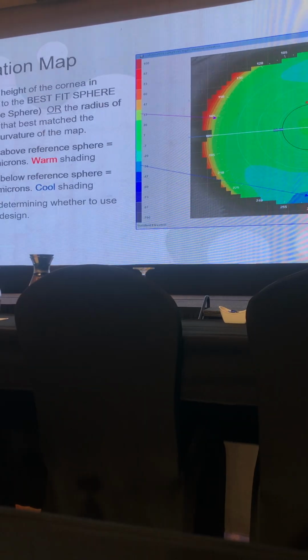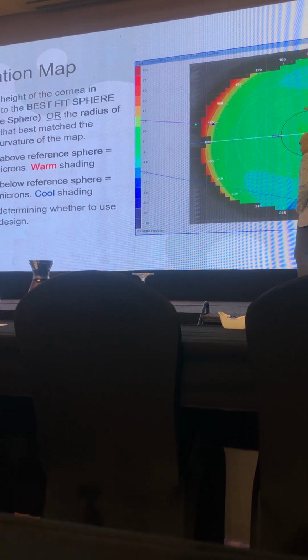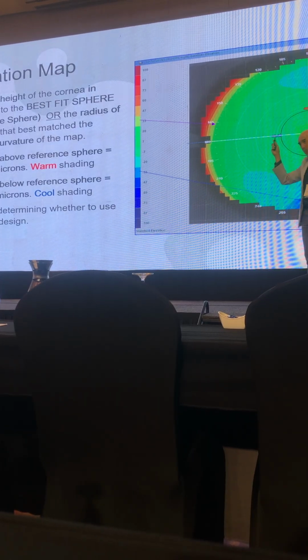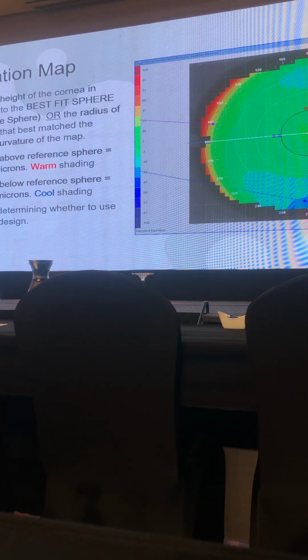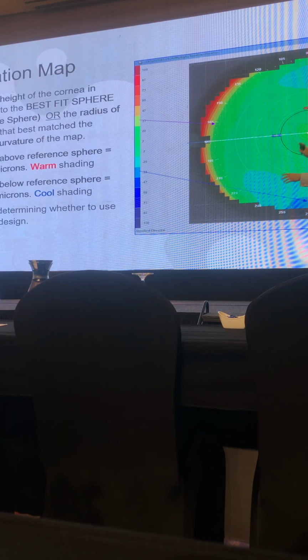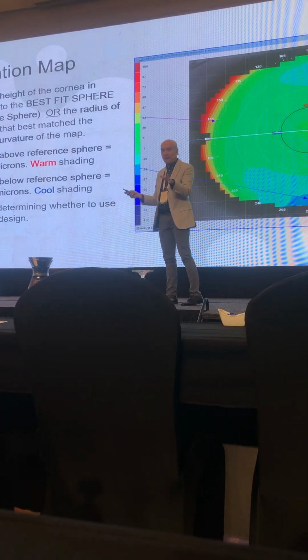What the elevation map shows you is that the topographic software will calculate this particular cornea and then show you the best fit sphere.